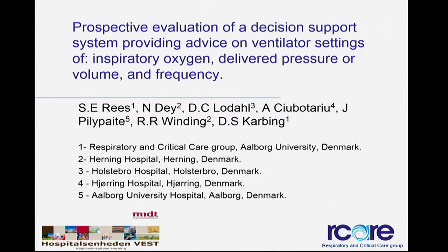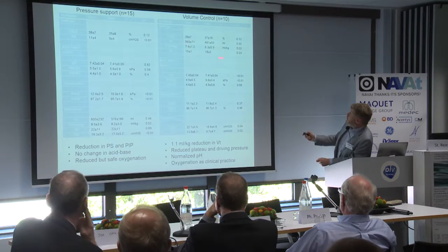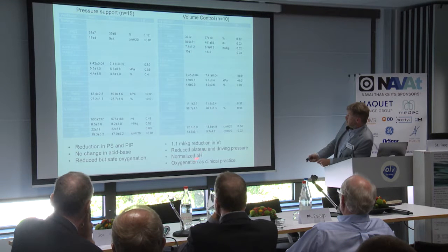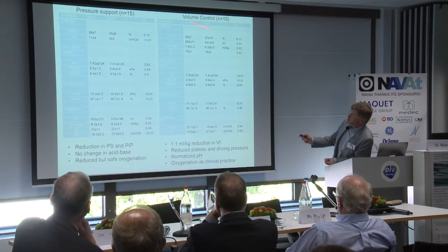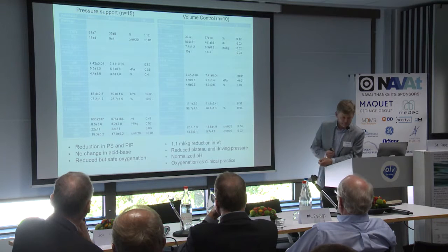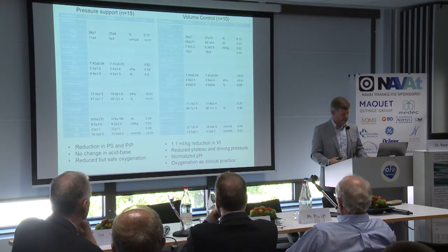In the first one, we looked at the system without advice on PEEP, and we showed that in 25 patients, over a period of 6 hours, we could improve the status of the patient if the advice was taken, reducing tidal volumes by 1.1 milliliter per kilo in a significant way, reducing plateau and driving pressure, and oxygenation was as clinical practice, with about 40% inspired oxygen. Of course, I should tell you the details of this, but that's not for today.